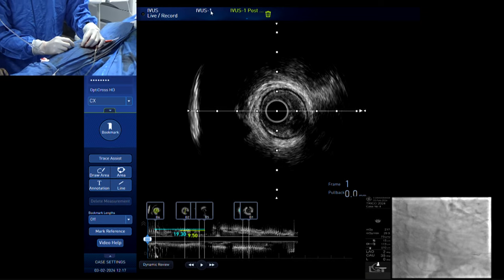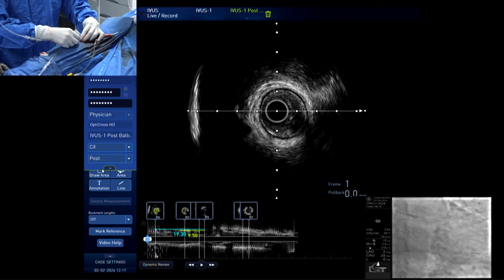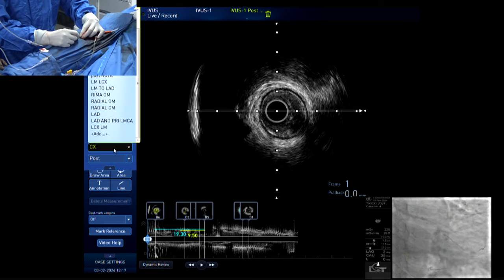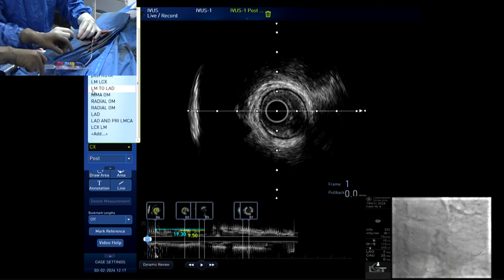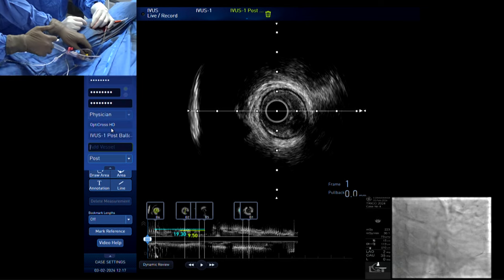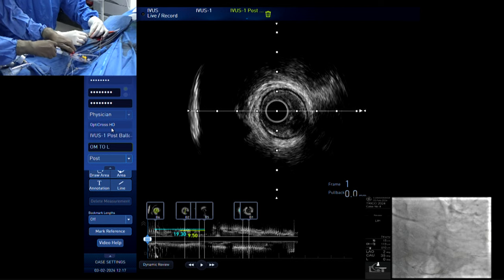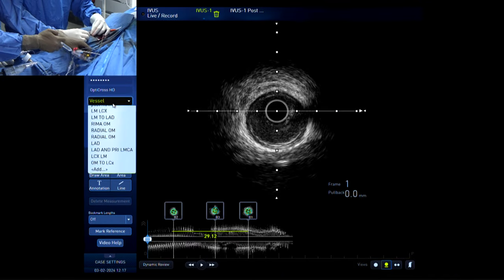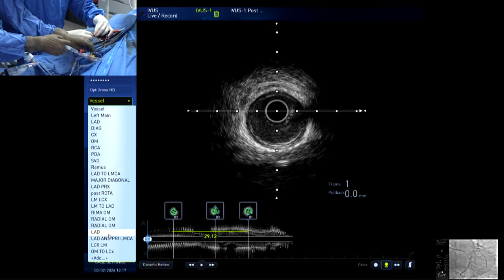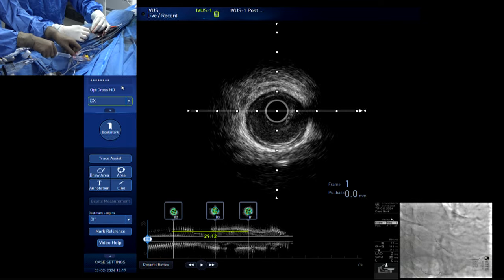So we put this balloon on the side and the stent protruding to the main branch. Okay, test for me. Just test. Okay, not bad. Can I take a picture here? Yes, just a second. Let me refresh. Ready? Okay, ready. Okay, good. I like the protrusion very much, about 2 millimeter back.